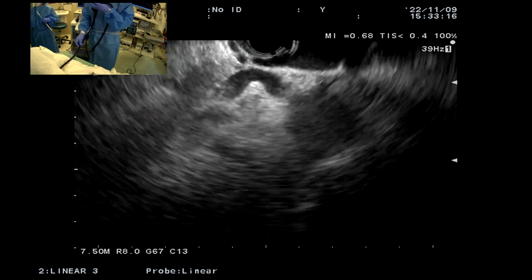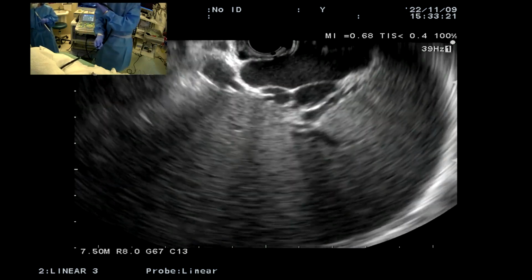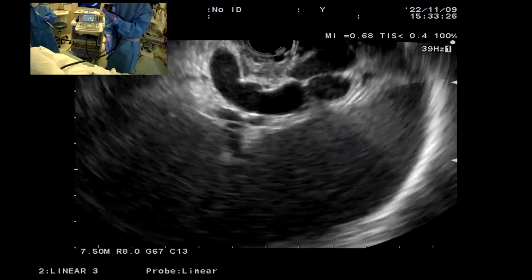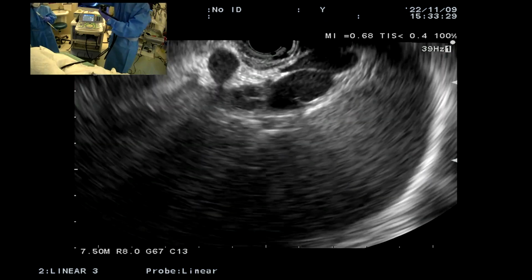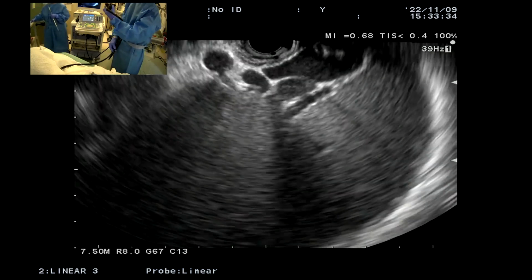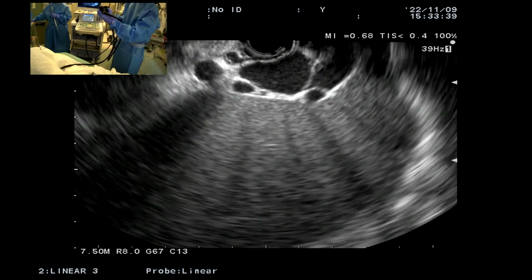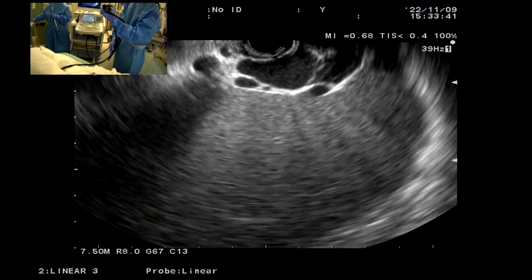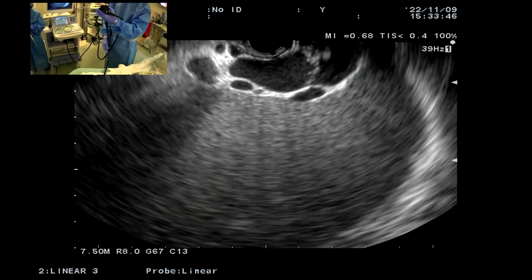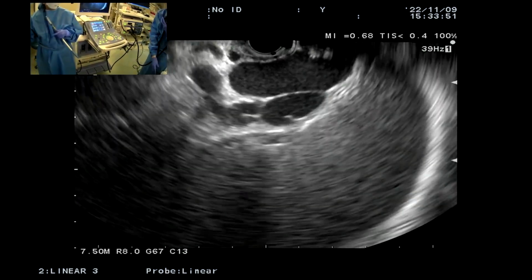All right, so I'm rotating like this to see if I can bring this into a position that's a little bit more assistant friendly, and here it is. So I'm going to bring everything over this way so that I can stand across from the screen and the assistant has access to the working channel. So we're going to swivel this screen all the way around so that it's across from me. And then I'm going to have an assistant hold the scope.